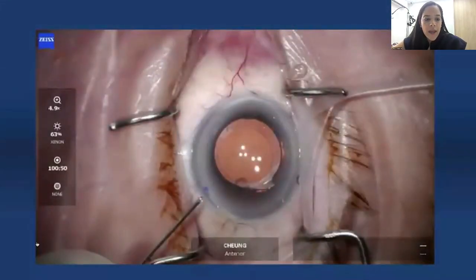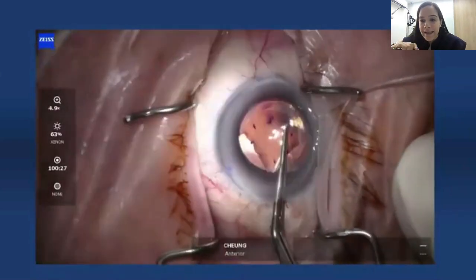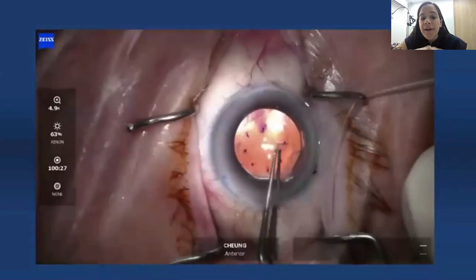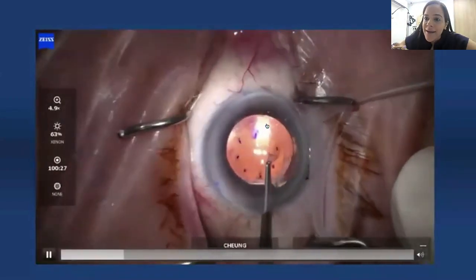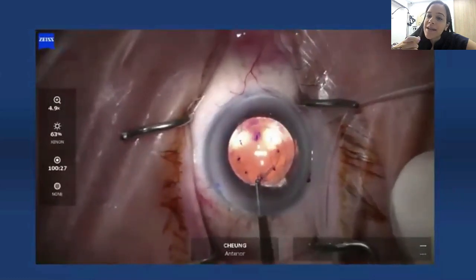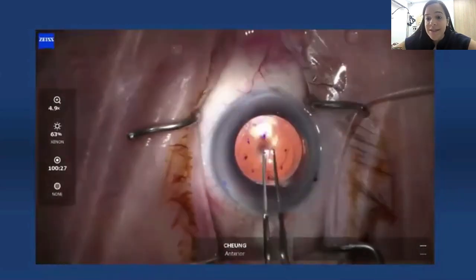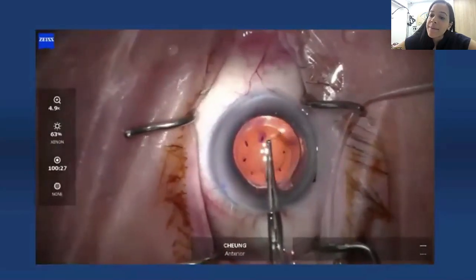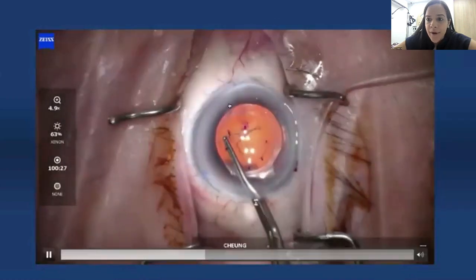The best way is using the peeling technique to maximize cell preservation and migration. After we mark our cornea in the video, we take the Sinskey hook with a side-to-side movement to create a small Descemet membrane tag. Then we pick that tag with the Gorovoy forceps, and the Descemet membrane will be peeled in a circular motion to the area that we marked.